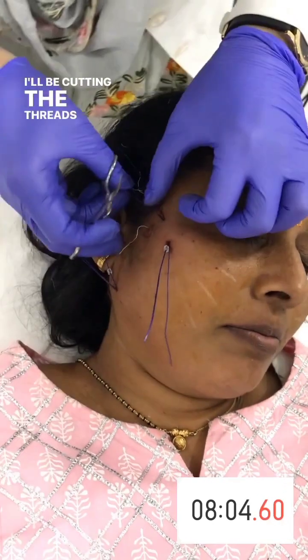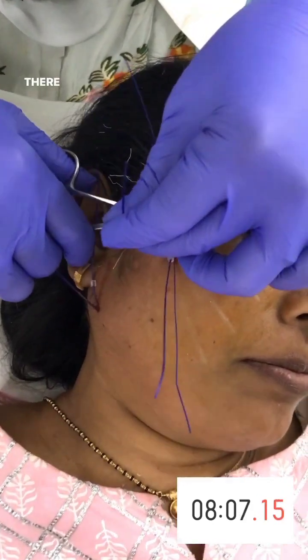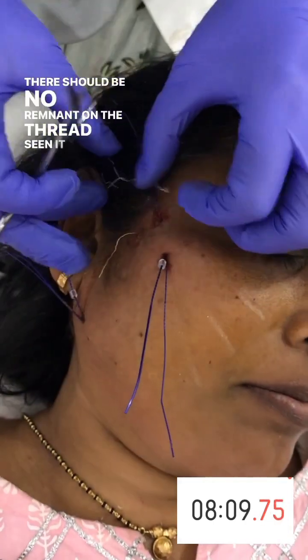I'll be cutting the threads very close to the skin. There should be no remnant of the thread seen. We'll be burying it under the skin.